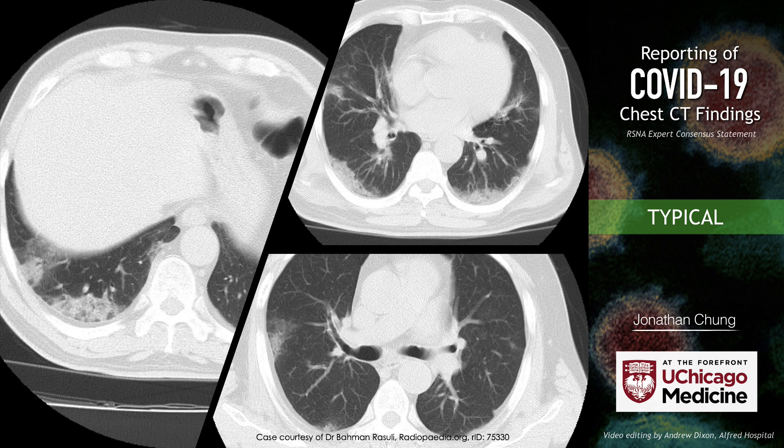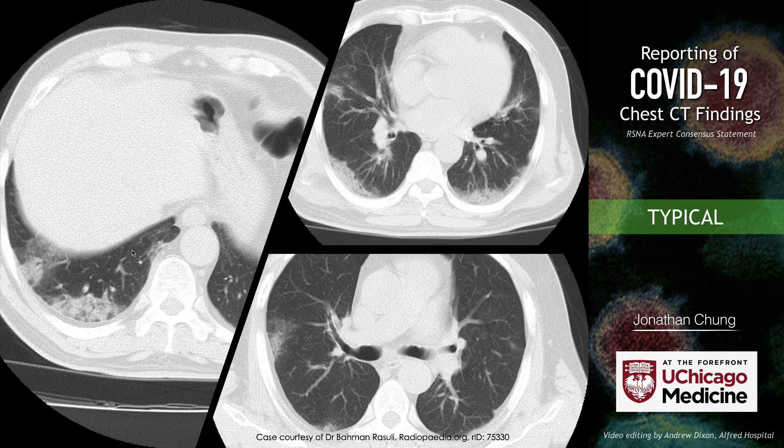Another example from Radiopaedia — there are multiple examples in the Radiopaedia case file of COVID-19, and I encourage you to look there. Bilateral ground glass opacity, a little asymmetric, with some superimposed consolidation as well — typical imaging appearance. Here's a patient with left lower lobe consolidation and ground glass opacity.